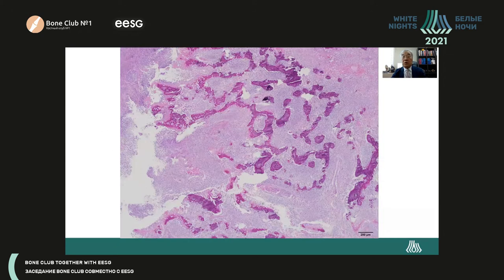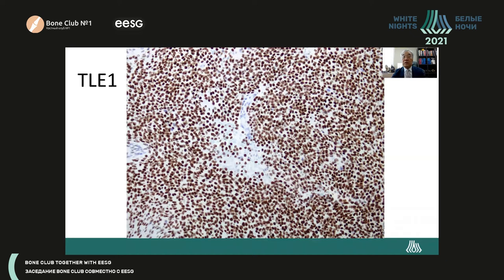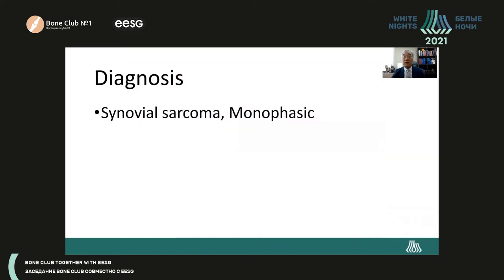On low-power view, you can see trabecular bones with diffusely infiltrative growth of tumor cells between the trabecular bones without any organoid pattern. The individual tumor cells show a fair amount of cytoplasm over vesicular nuclei, and nucleoli are not prominent. With TLE1 immunostaining showing intense nuclear staining, the final diagnosis for this first case is monophasic synovial sarcoma.